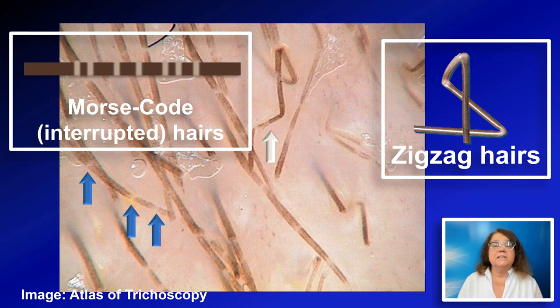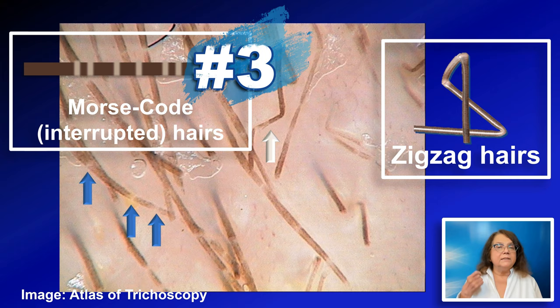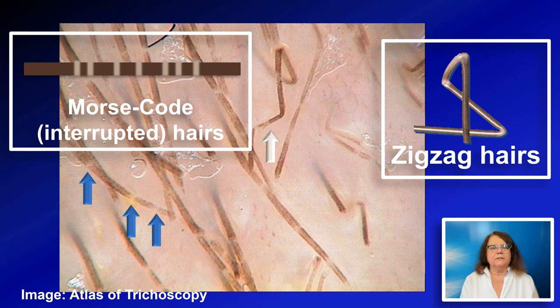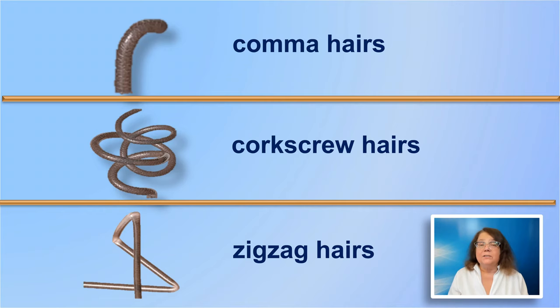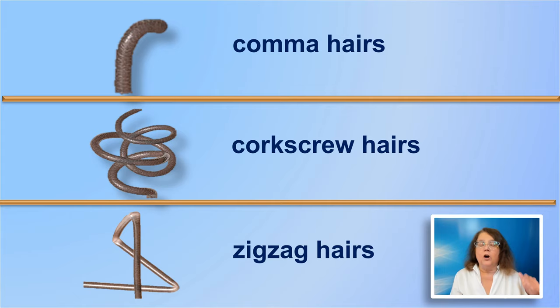Two more typical trichoscopy features of tinea capitis: number three are the Morse code hairs or interrupted hairs, marked blue at the bottom of this image, showing typical interruptions along the hair shaft. Feature number four are the zigzag hairs — hairs which bend at a very sharp angle. So the four most typical trichoscopy features of tinea capitis are the comma hairs, the corkscrew hairs, the Morse code hairs, and the zigzag hairs.